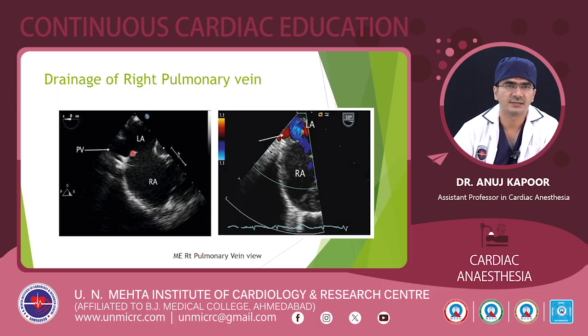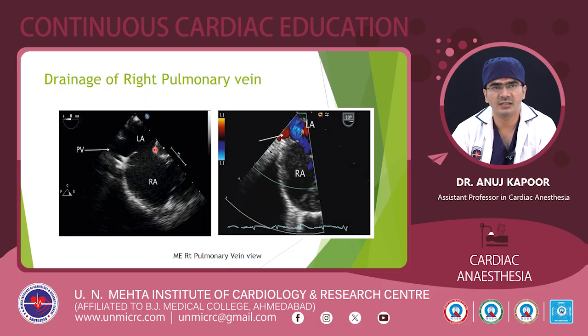Now we will assess the drainage of the right pulmonary vein. So getting a mid-esophageal right pulmonary vein view, we will assess whether the right upper pulmonary vein and lower pulmonary vein are draining into the LA or not.